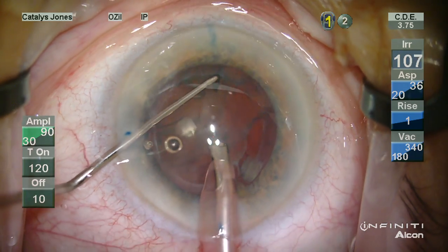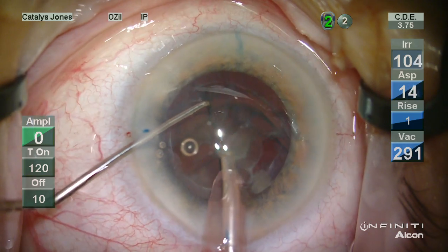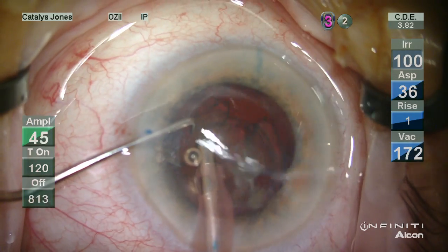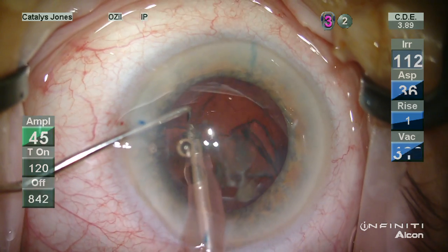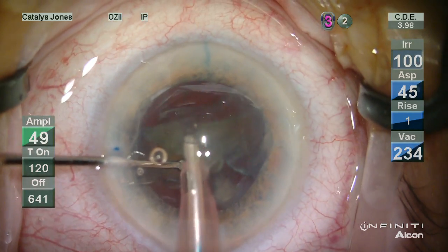I find this burst pattern provides a nice balance between ultrasonic efficiency as well as minimizing the amount of fluid passed through the eye.